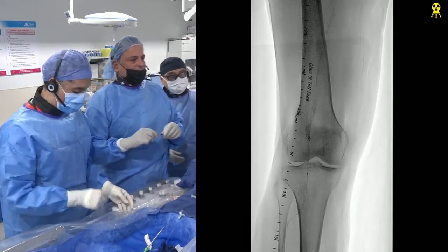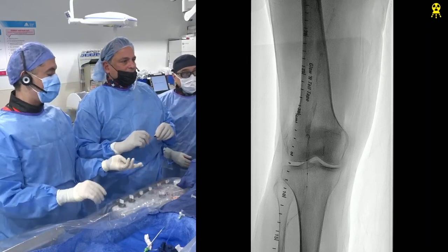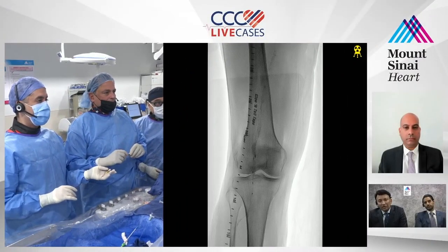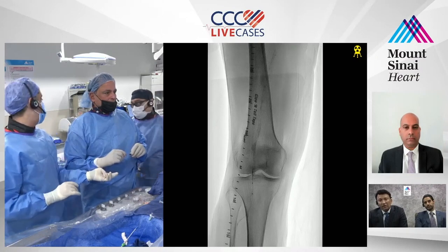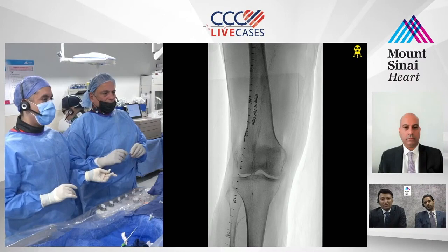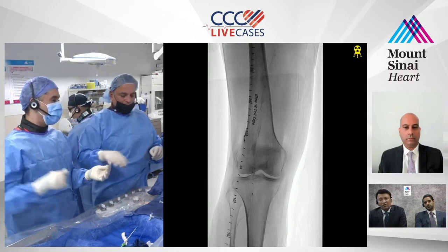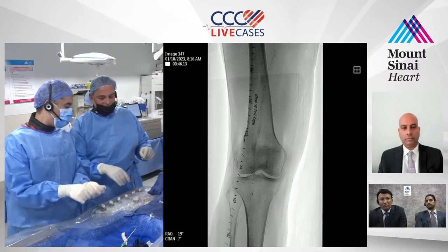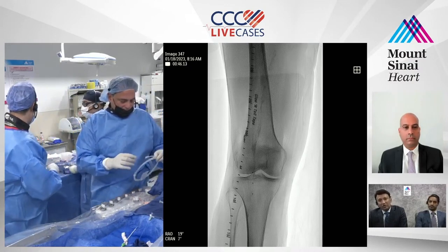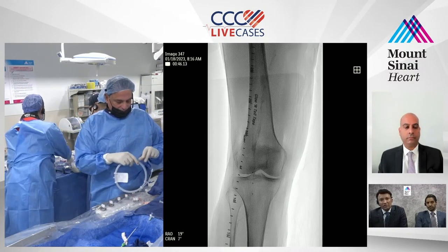Yeah, there we go. Let's see. If you don't have a problem putting a 5-6 Slender into this AT, I think it's okay to go pedal. And I agree actually with Srini. I would have probably taken a posterior tibial access. This is a Fielder. Because even if you have to put a 6-French sheath to deal, the problem will be to deal with that CFA, right? What therapy? I know you want to do Shockwave, but again, you need a 6-French sheath.